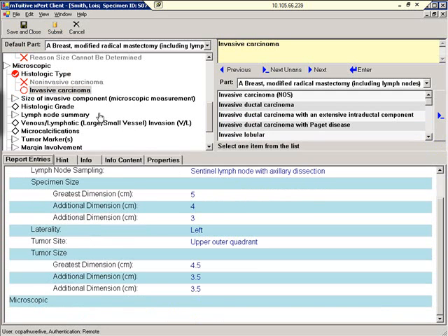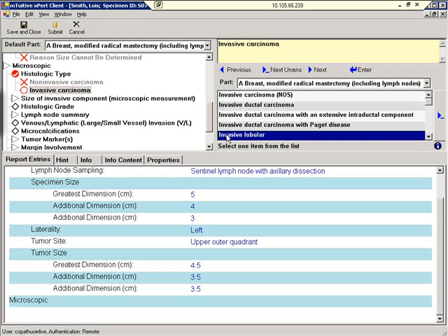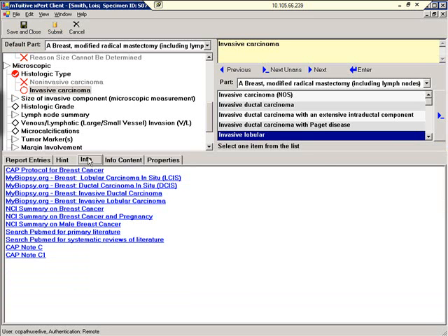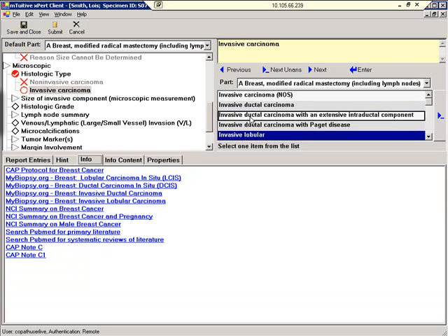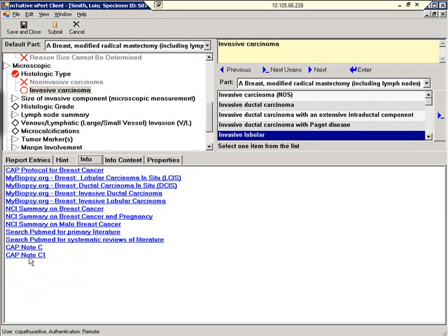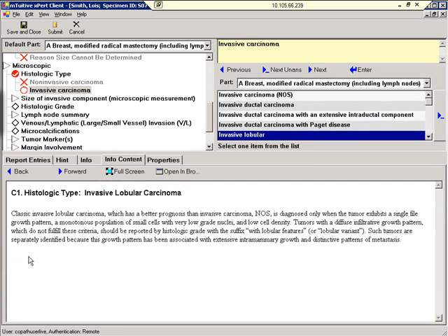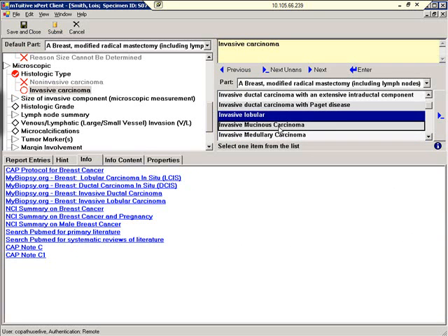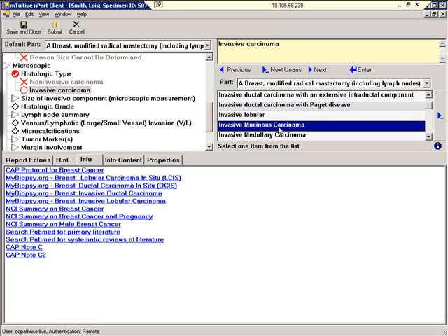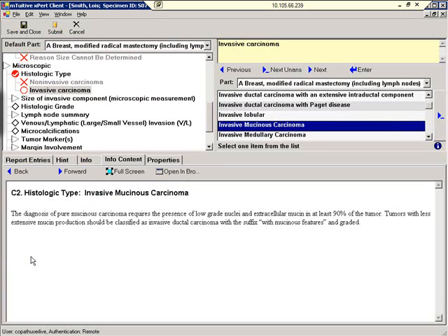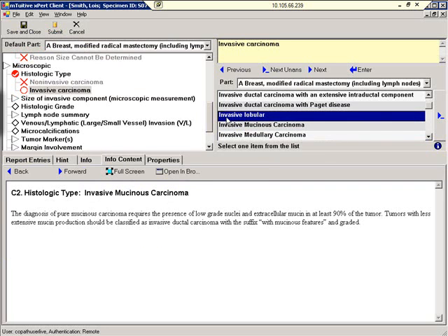Let's take a moment to learn how the Info tab works. We'll begin by highlighting Invasive Lobular. We'll click on Info. You can see that the system only provides you with context-sensitive info that's applicable based on where you are in the report. As you can see, CAP note C1 is available. CAP note C1 pertains to invasive lobular carcinoma. Now if we highlight Invasive Mucinous Carcinoma, you can see that CAP note C2 becomes available. And that note pertains to invasive mucinous carcinoma. The system can also perform a contextual search based on the data we've input thus far.